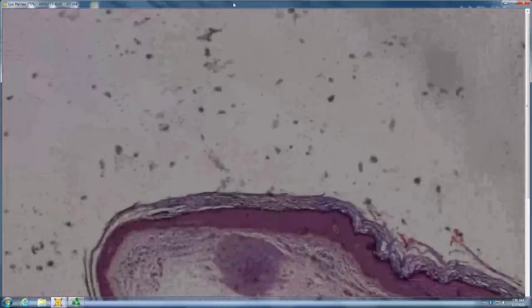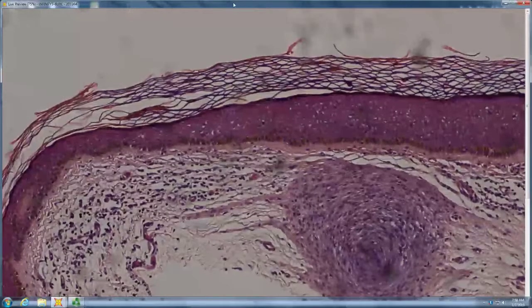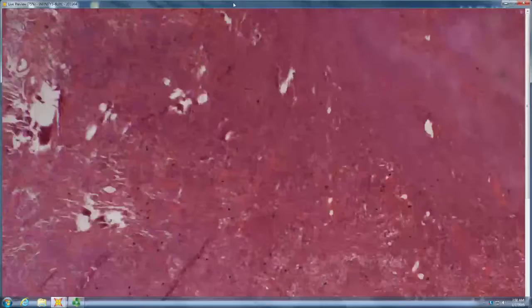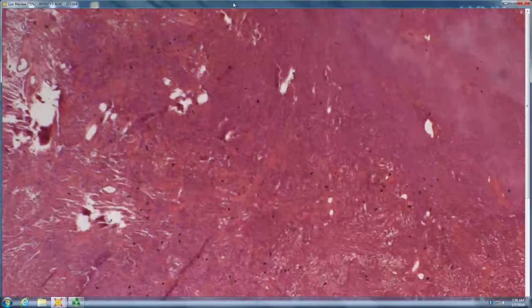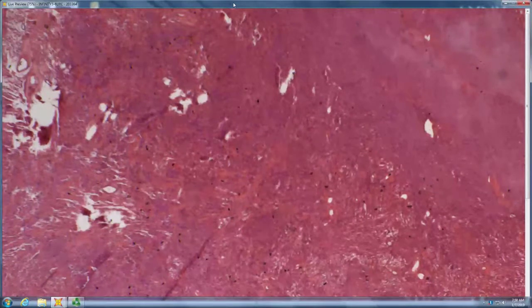Multiple nodules, a little onion skin. So this whorl, this is another sclerosing perineurioma. Those onion skin whorls are the giveaway. Perineuriomas are not always sclerosing, but the ones we see in skin, 99% are sclerosing. There are soft tissue perineuriomas that are not sclerosing, but we rarely see them in skin. The ones we see in skin are almost always sclerosing.